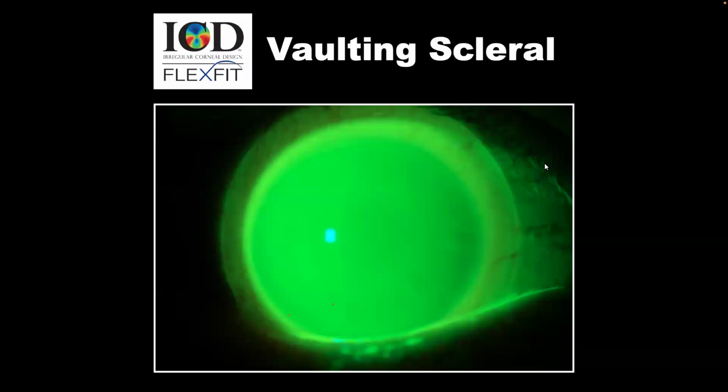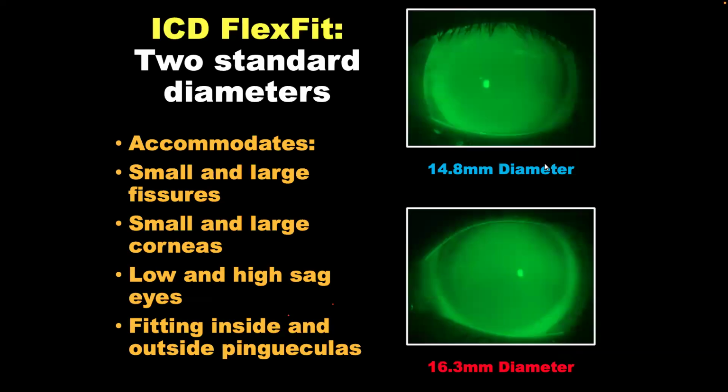One of the things that we always try to achieve with a scleral lens is vaulting the apex of that cornea, right? We need to achieve vaulting that apex, the limbus, and just try to have that smooth landing with that scleral lens, just to avoid a lot of complications that can be caused by a tight lens.